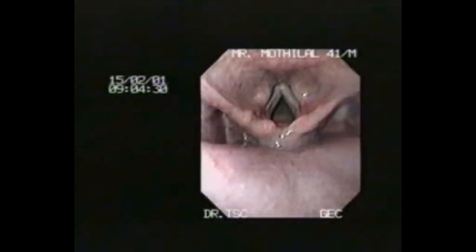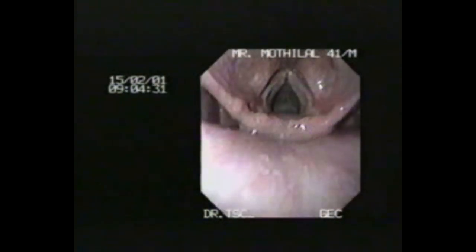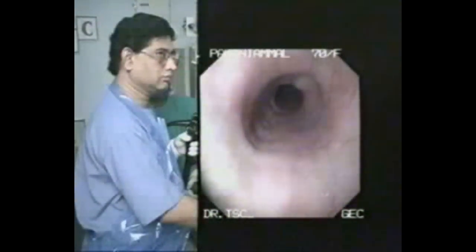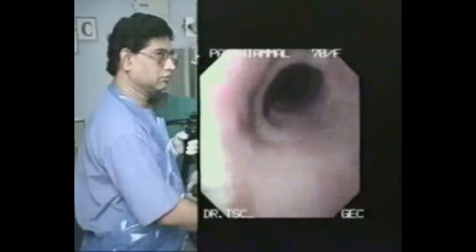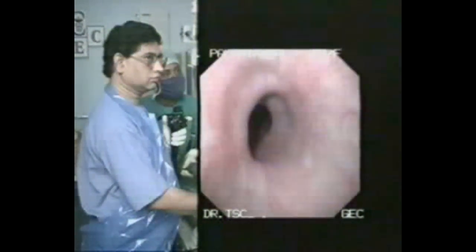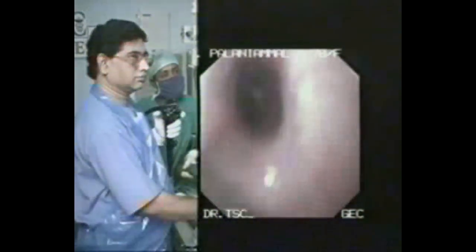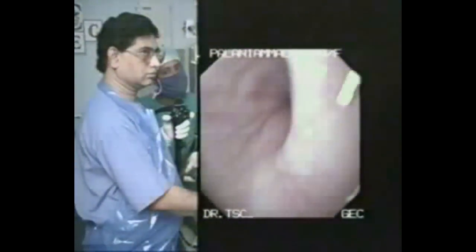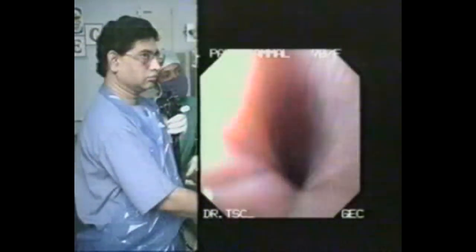Vocal cords can be examined comfortably with a direct visualization technique. One must aim at a tunnel view of the esophagus to note the transmitted cardiac pulsation and peristaltic movement. Spend more time at the lower end of the esophagus and across the GE junction to diagnose hiatus, esophagitis, and achalasia cardia.